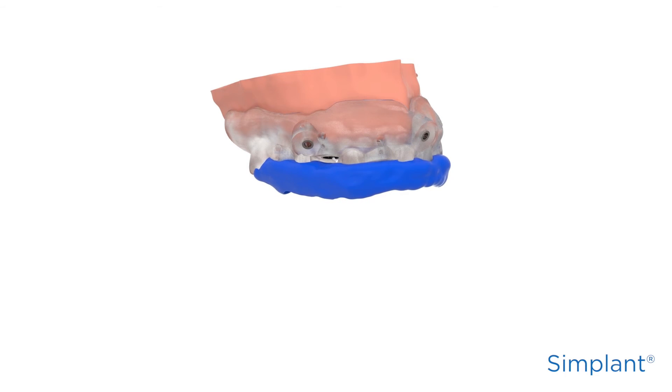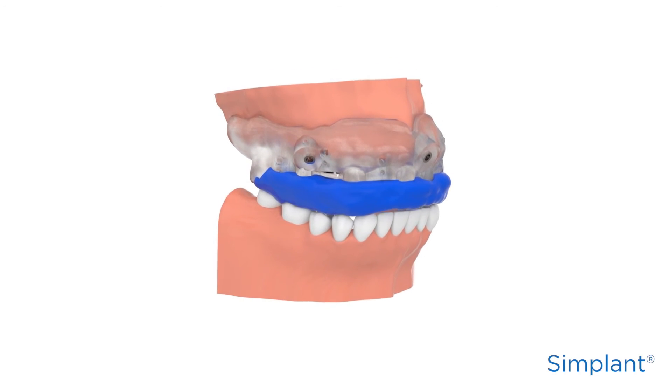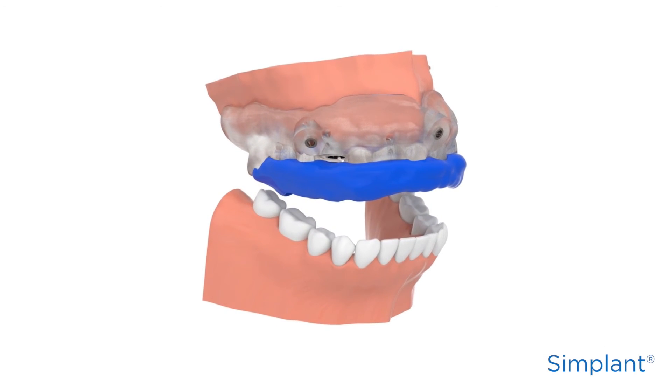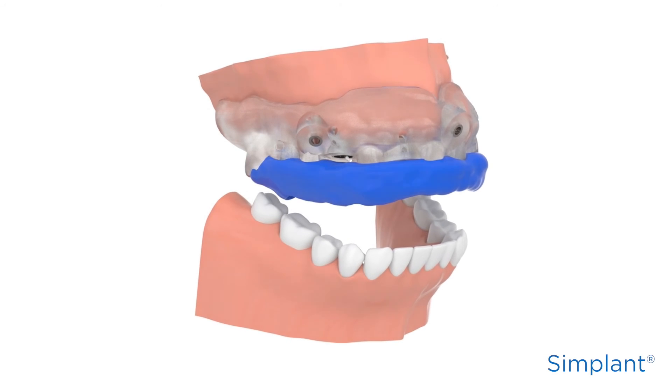the bite index that you made for the scan can be used as the surgical index. If insufficient teeth remain in the Simplant Guide design, it is recommended to make a surgical index directly in the patient's mouth using standard indexing material.